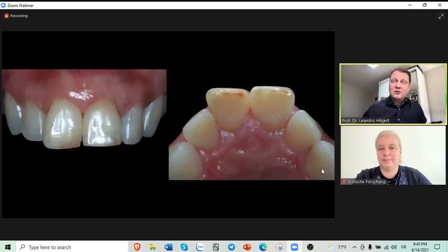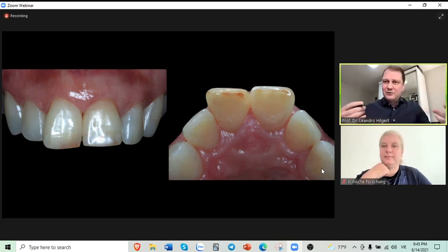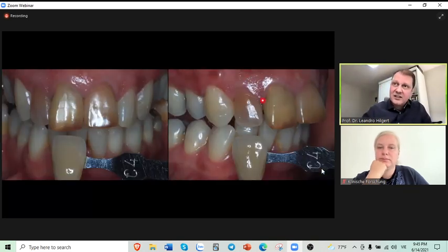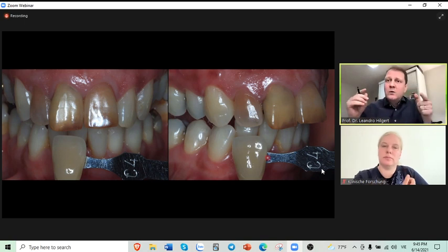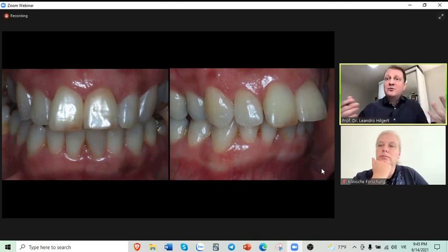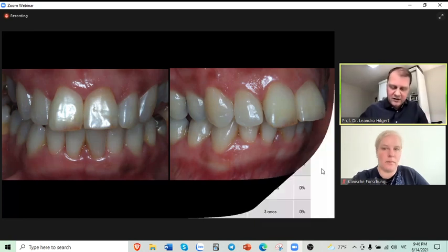And from that situation that she presented to us, now she is in this kind of shade here, and now we just need to do some, I would say, details in the incisal area. So if you look here, I always ask people, please pay attention here in this lateral here that is much darker than the C4 shade tab. That is the darkest one that we have. And look what happened there with 3 weeks. And now we don't need 3 crowns anymore. And we did a very micro-invasive treatment, and we met the demand. We solved the problem. The demands of the patients were solved.